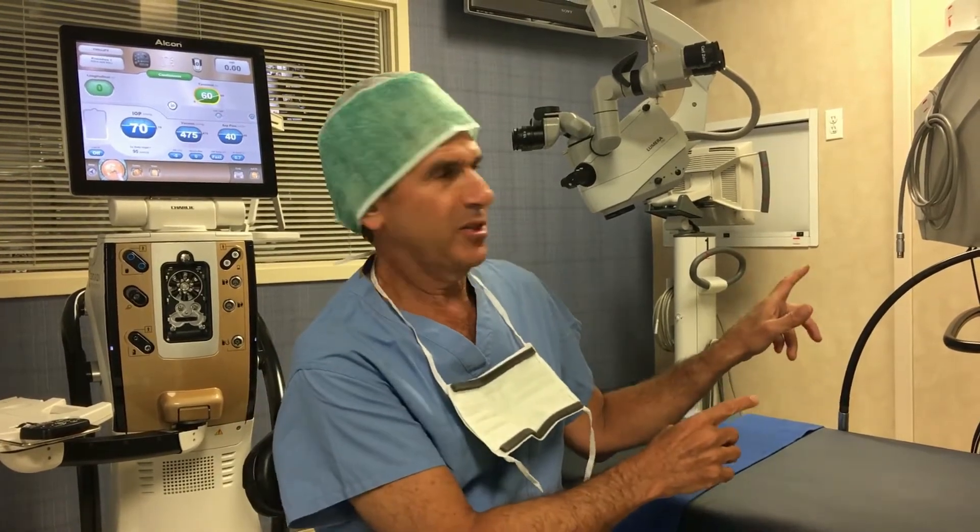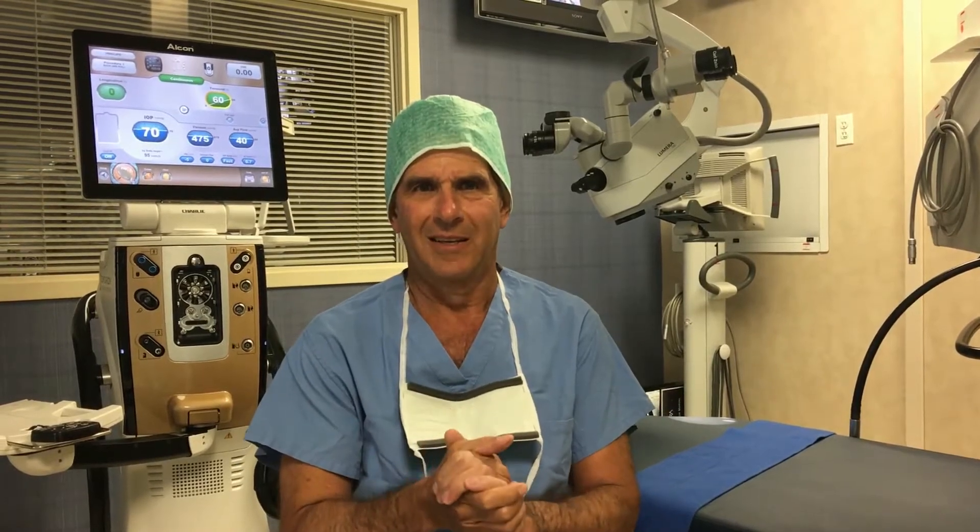In a few moments our next patient, who is presently receiving anesthesia, will be coming in for me to perform their cataract removal with insertion of a Symfony toric lens implant. The Symfony is the newest advanced technology implant that can provide an extended range of vision from far away all the way into 18 inches. We will be inserting a toric model of the Symfony that will also correct the patient's astigmatism.